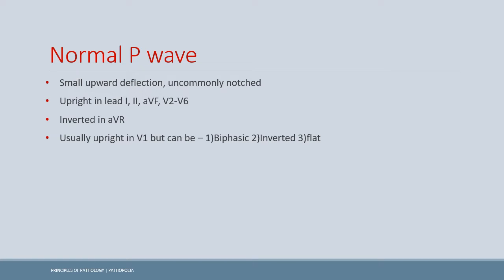Now let's discuss the features of the normal P wave. The P wave is a small upward deflection and is smaller in comparison to the QRS complex. The SA node is present in the right atrium, which contracts earlier than the left atrium. When the left atrium contracts shortly after, this can cause a notchy appearance in the P wave.